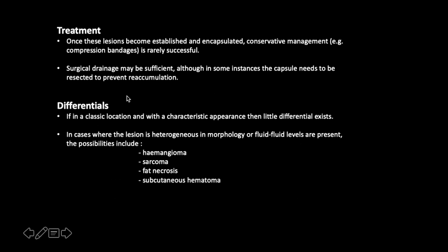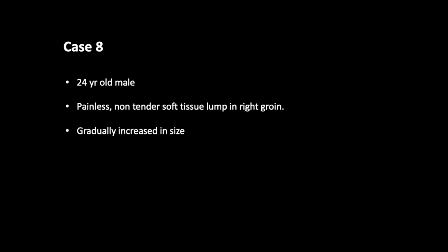What is the differential? If it's in the classical location and has a characteristic appearance, there are fewer differentials. But there can be fat necrosis, subcutaneous hematoma, and hemangioma as the differential diagnosis.